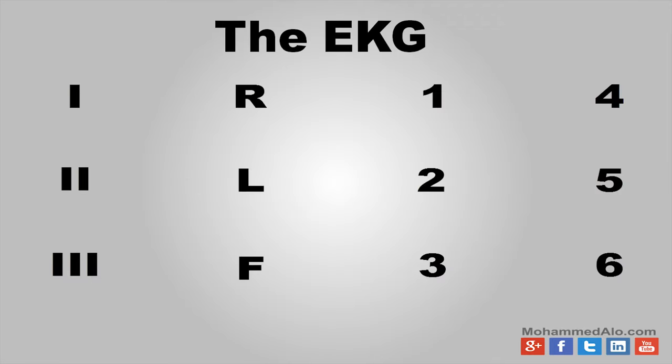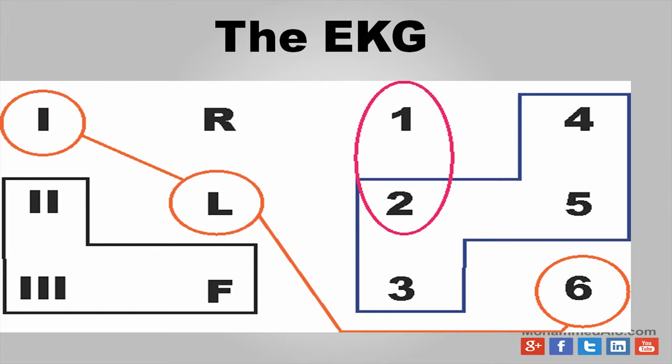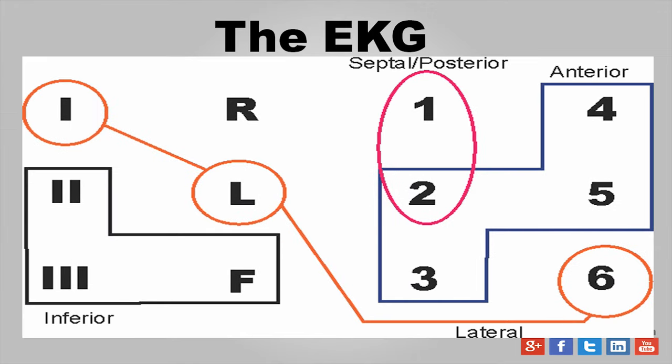Next, look at this EKG here. This is basically what the EKG looks like. Your limb leads are 1, 2, and 3, R, L, and F. Your V leads or your chest leads are V1 through V6. This shows all the different parts they represent. I put all the walls together. Like the magenta, for example, is the septal wall. The blue ones are the anterior wall, etc. On the next slide, you'll see I put the words next to each wall.